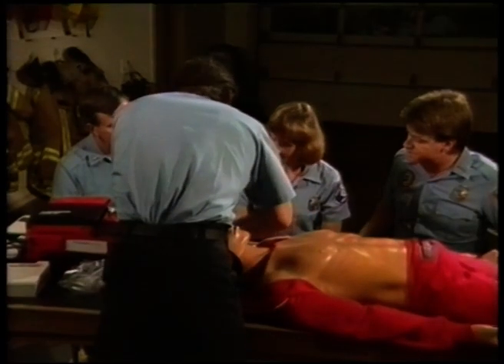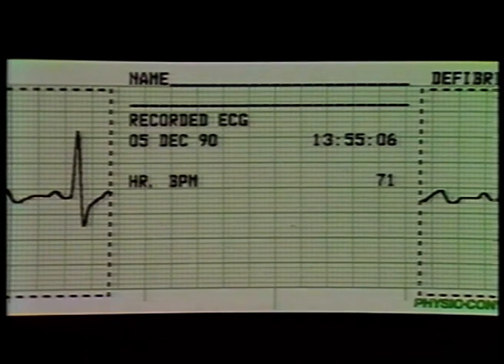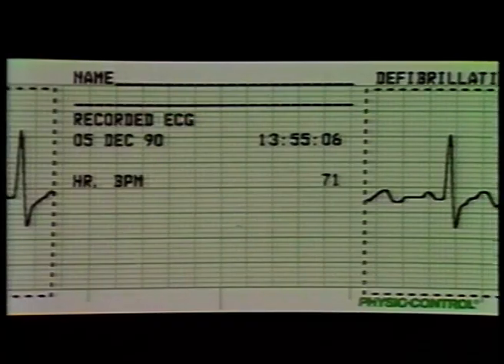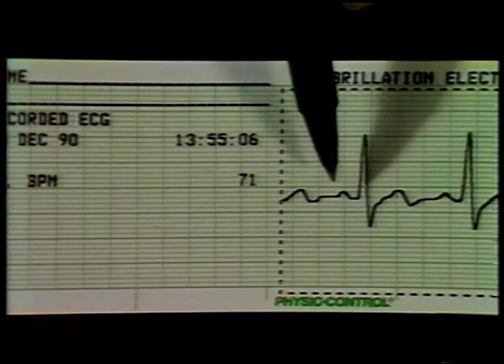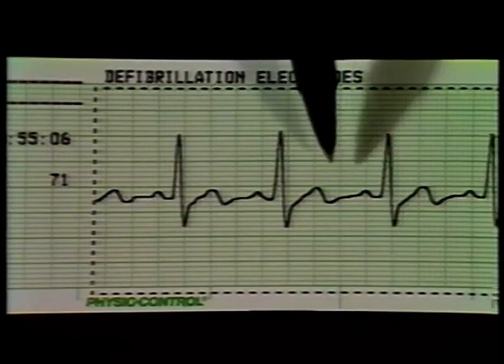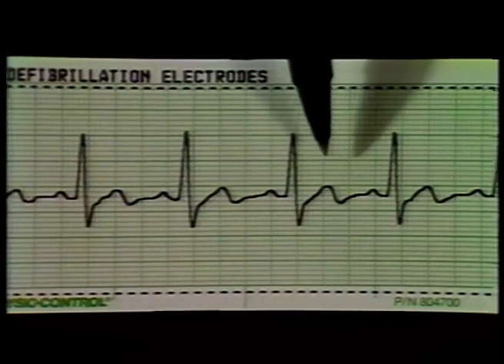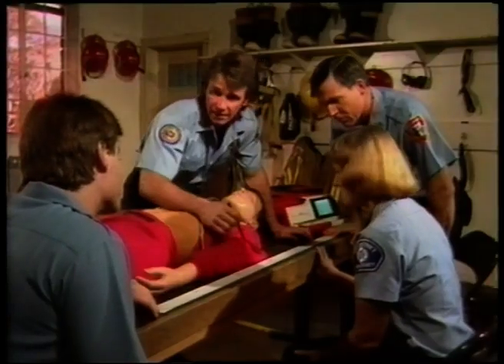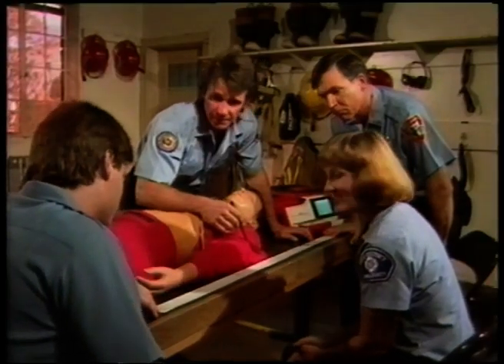This is the recorder format. Each time the printer is used, the device stores 6 seconds of the patient's ECG starting from when the printer button was activated. This concludes an explanation of the Code Summary Critical Event Record. The LIFEPAK 300 can store up to 25 individual events with the accompanying patient ECG.